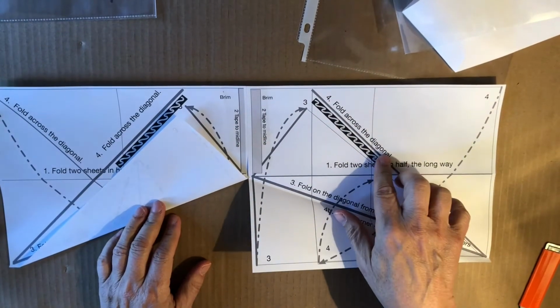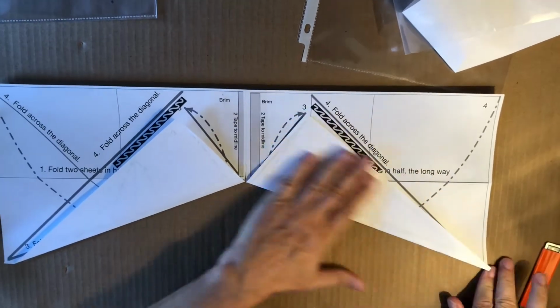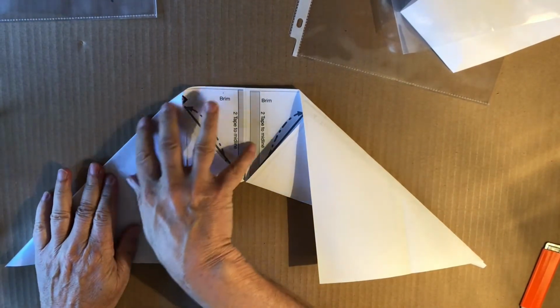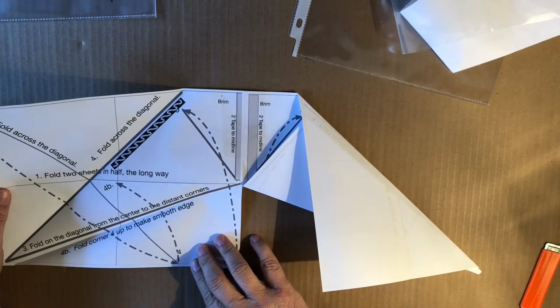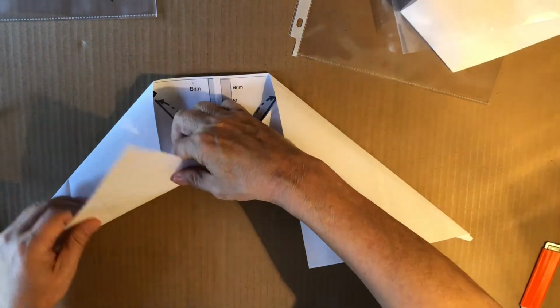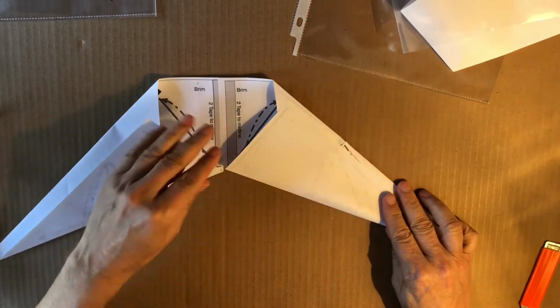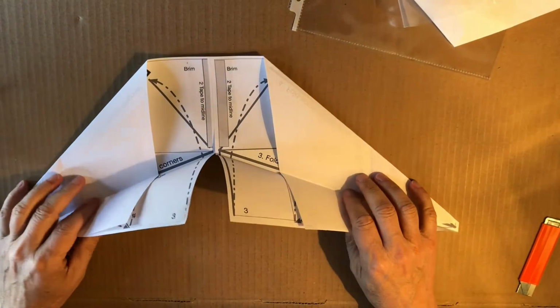Now it says here, 4, fold across the diagonal. That means like this. Now, I'll grant you that as we fold, we hide our instructions, but that's the breaks. If you peek, you can see that the last step, 4B, is to fold corner up to make a smooth edge. So we are folding here like this, and similarly we are folding here like this, and that's the shape.